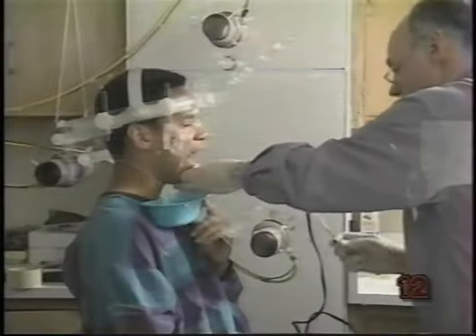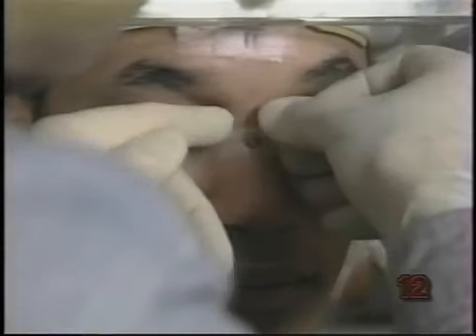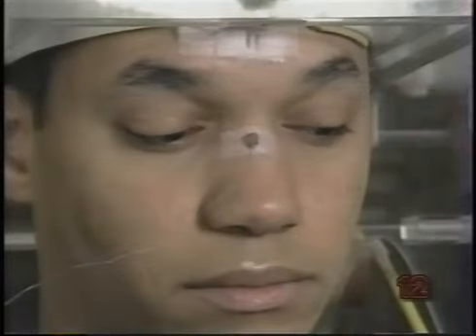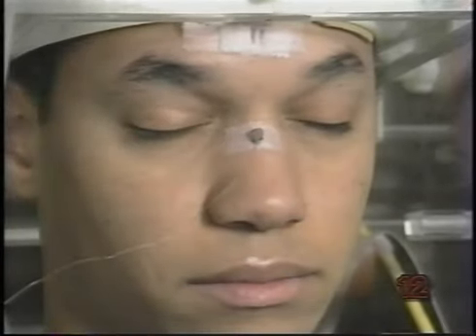Next, we mount the transducers on the subject's articulators. We use a biocompatible rubber cement for extraoral placements and a biocompatible cyanoacrylate for intraoral placements. As we mount each transducer, we position it as close as possible to the midline, and we keep its axis perpendicular to the mid-sagittal plane.